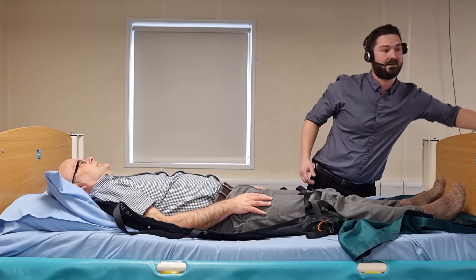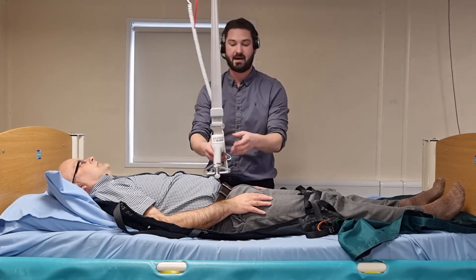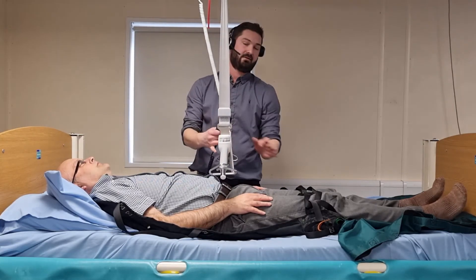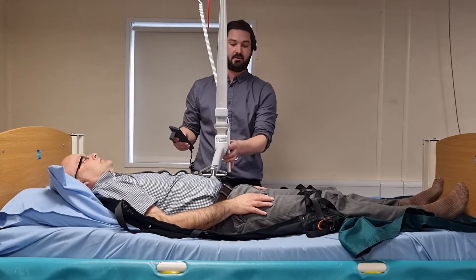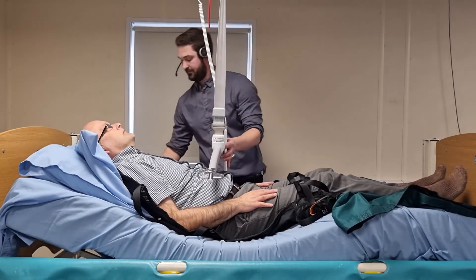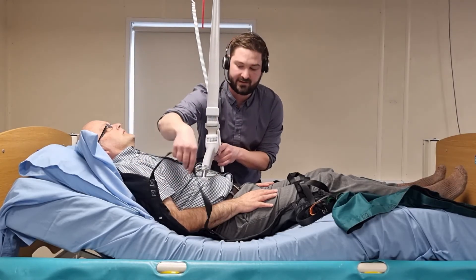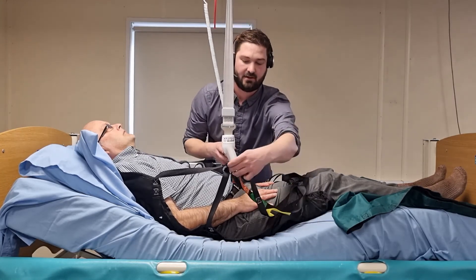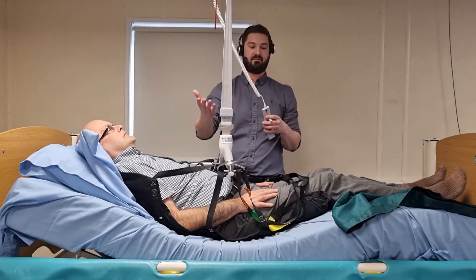I'm going to bring my carry bar in. Before I attach the loops, I'm going to profile the bed — bringing up the knee brace and the head and backrest together. This creates a more comfortable hoisted position. The loops will be pre-assessed by the prescriber. Once they're attached, I'm just going to double check that I've got them on securely before I actually start taking him up off the bed.